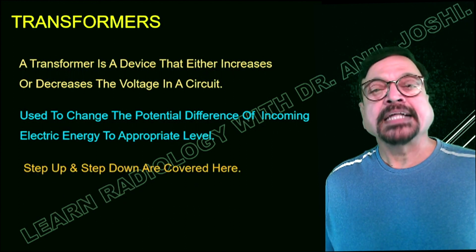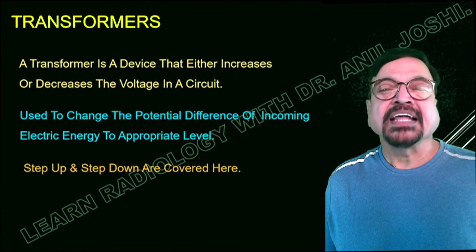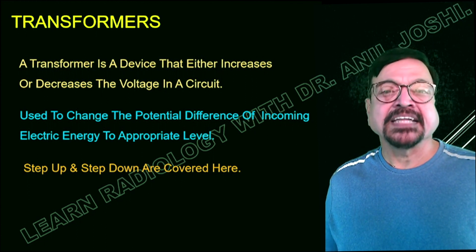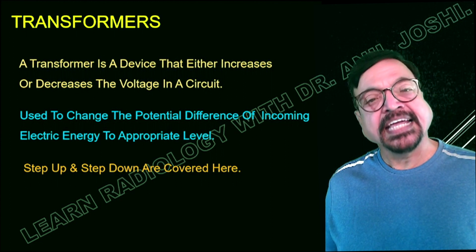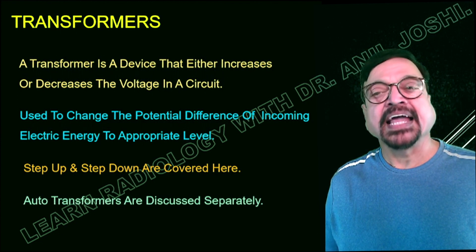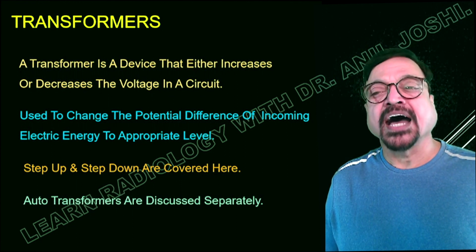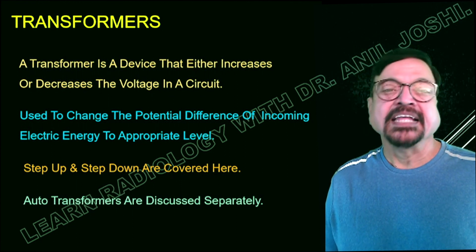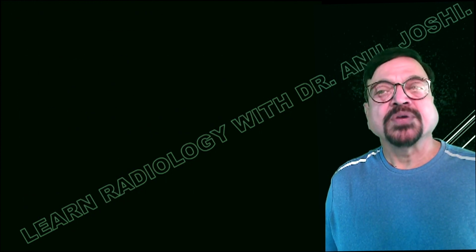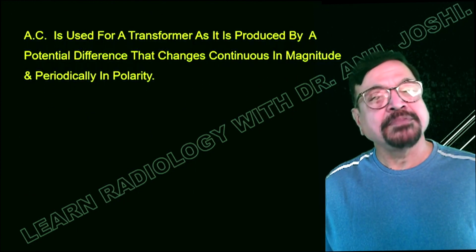Now step up and step down are the names used when the voltage is increased, that is step up, and when the voltage is decreased, that is a step down transformer, as compared to the incoming line. Auto transformers are discussed separately and their applications are also different. Today's topic is step up and step down transformer.